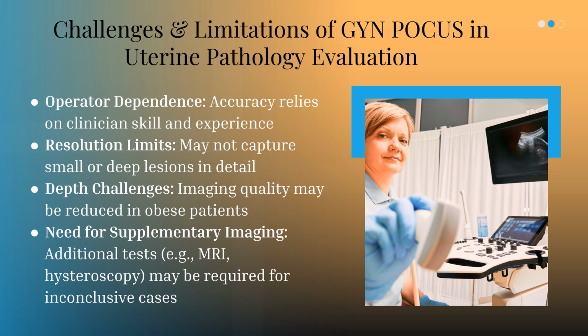If you aren't skilled, if you've mostly done obstetrical ultrasounds and then all of a sudden you're joining a GYN practice, you need to get some skills and training to know what you're looking for. It's completely different with uterine abnormalities and ovarian abnormalities than when you're looking at placental location and newborns, the fetal anatomy, those kind of things. So you want to be able to know the limits of your resolution.